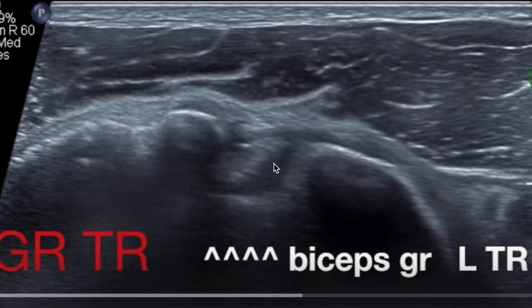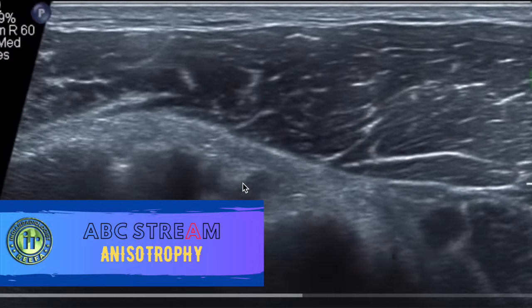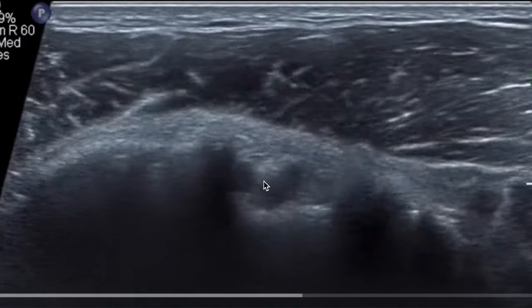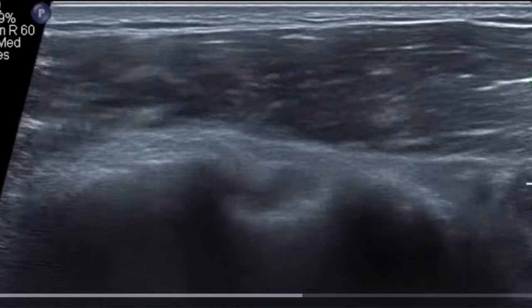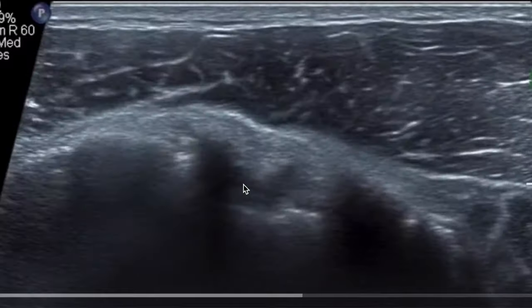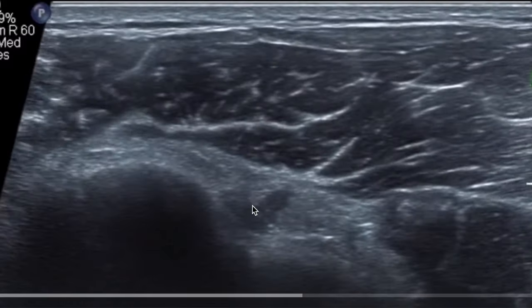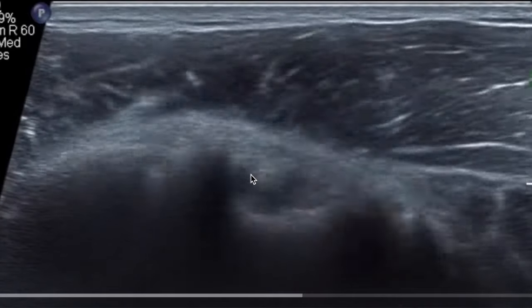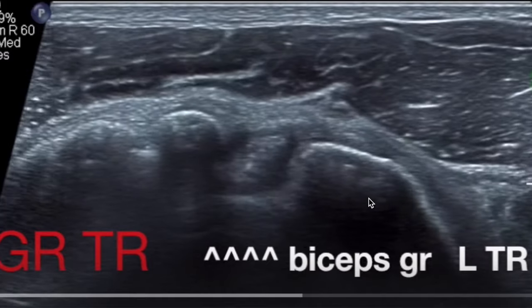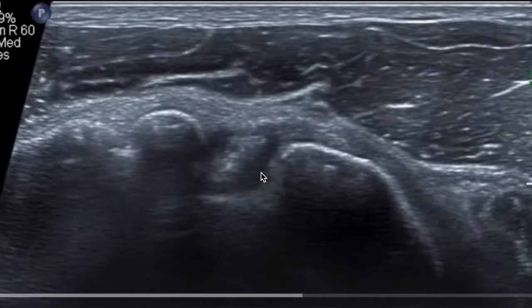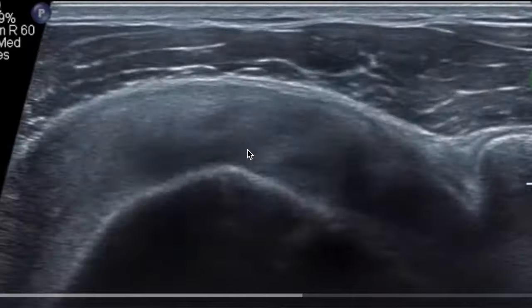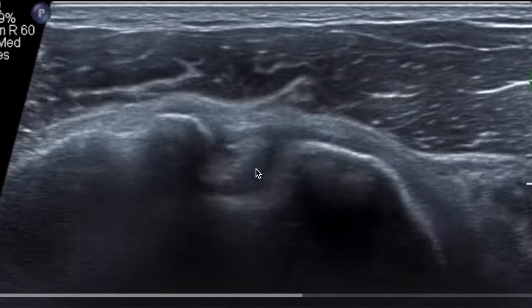Anisotropy is an artifact encountered especially in muscles and tendons during musculoskeletal examination. When the ultrasound beam is incident on a fibrillar structure such as a tendon or ligament, the fibrils reflect the majority of the sound beam away from the transducer, so the transducer receives no signal back and assumes the area is hypoechoic. This can lead to an incorrect diagnosis of tendinosis or tendon tear. On the image of the biceps tendon, a hypoechoic area within the tendon is visible — this is not an abnormality, but the artifact of anisotropy.